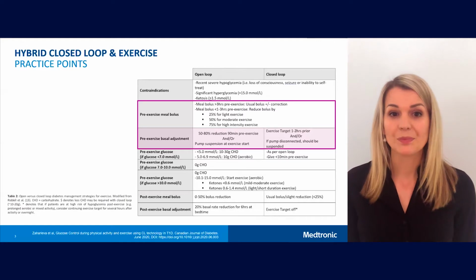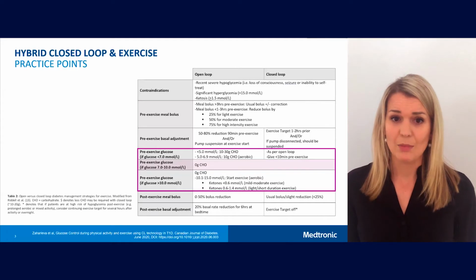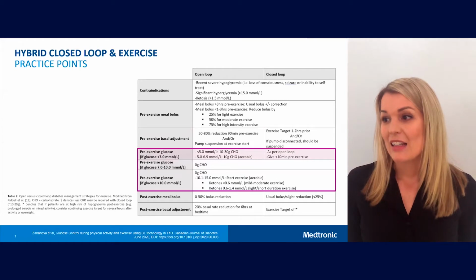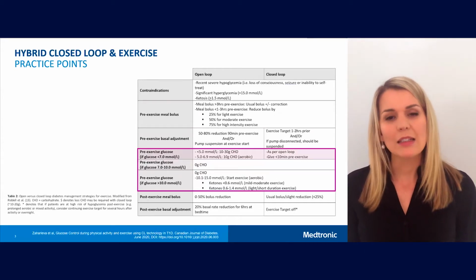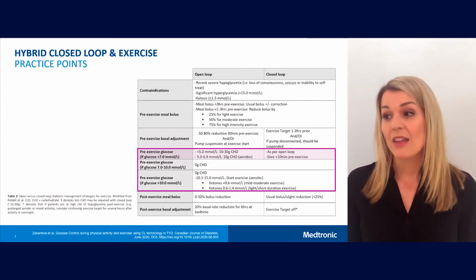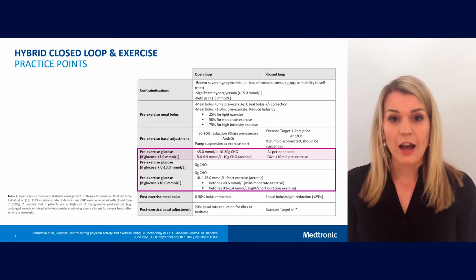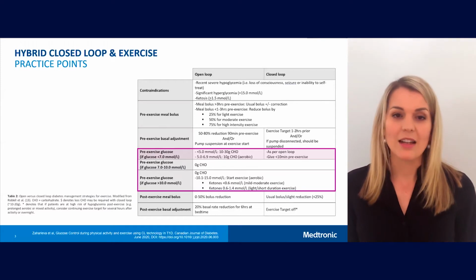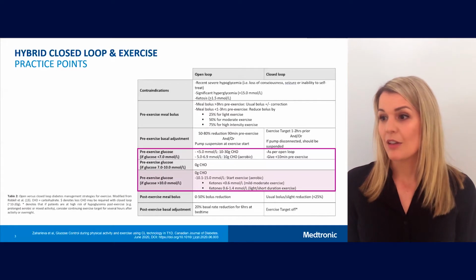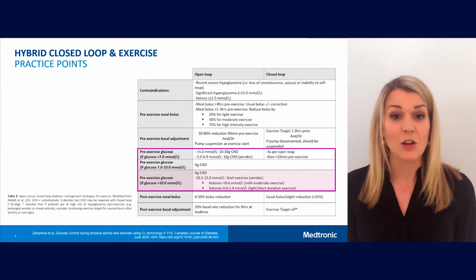algorithmic calculations. For pre-exercise glucose aim, a reasonable starting glucose is 7 to 10 millimole per litre, but of course this can be individualised. If it's less than 7, carbohydrate is recommended, but it's important in hybrid closed loop that the carbohydrate is given as close to the exercise as possible so that it doesn't trigger an auto-basal increase. If the glucose is less than 5, then of course treat and recheck and don't start exercise until it's greater than 5. For pre-exercise glucose levels of greater than 15, check ketones, and if greater than 1.4, exercise is contraindicated.